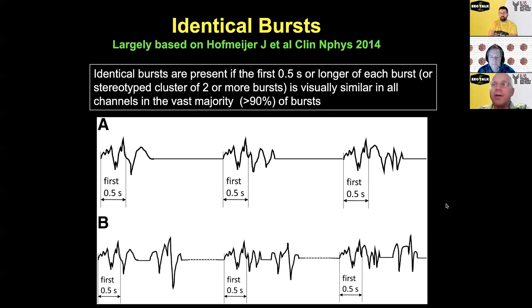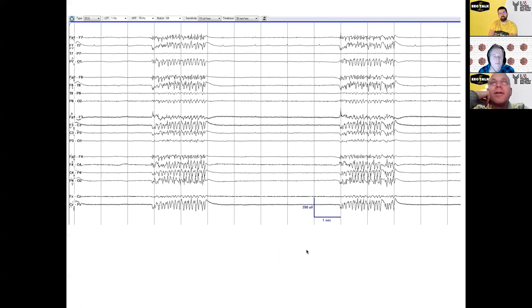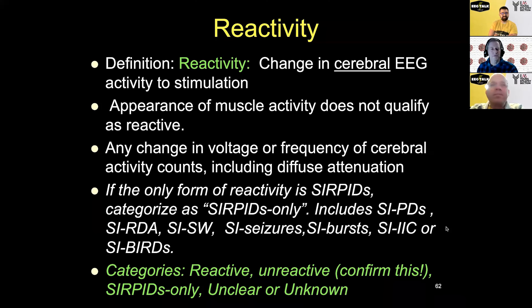The idea is that if the brain is severely injured, it can only generate one pattern. Looking at this example — are they identical? They're complex, which makes it harder to judge. Only the first half-second counts, so if you pick any particular area here, the first half-second is remarkably identical. We would call this identical bursts, and since these are all poly spikes, they are also highly epileptiform.